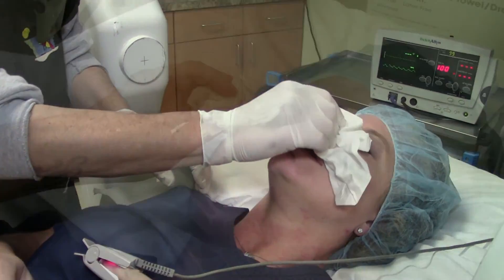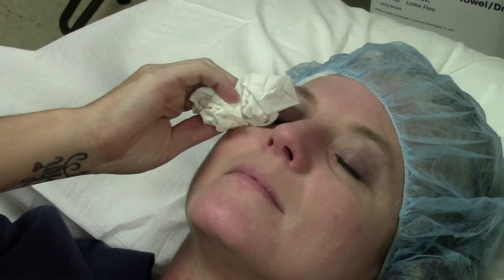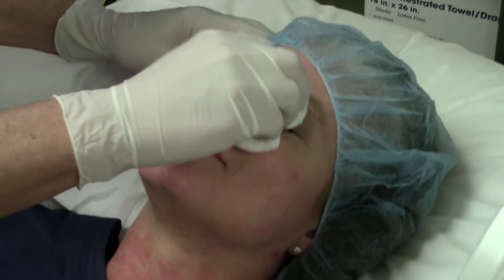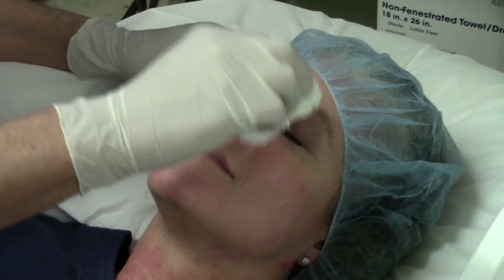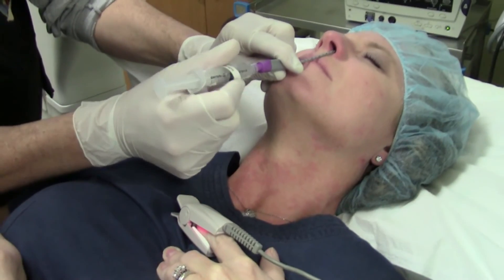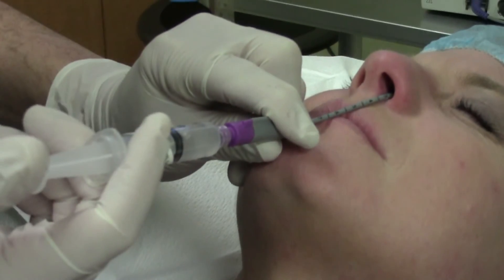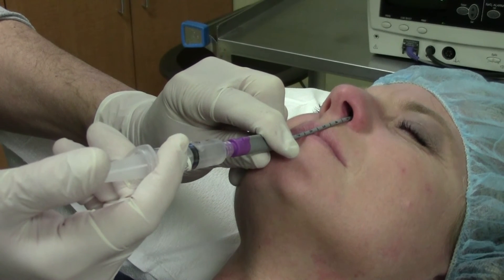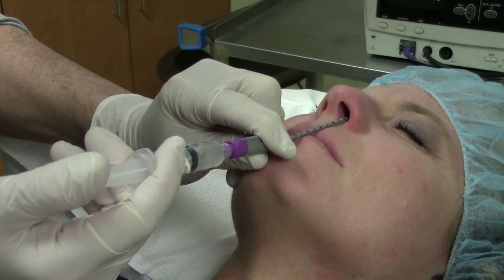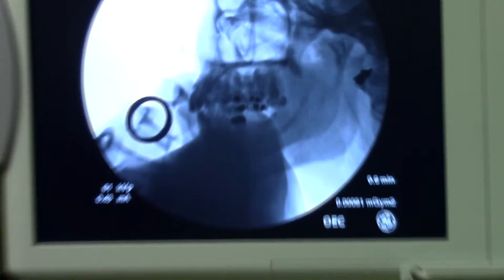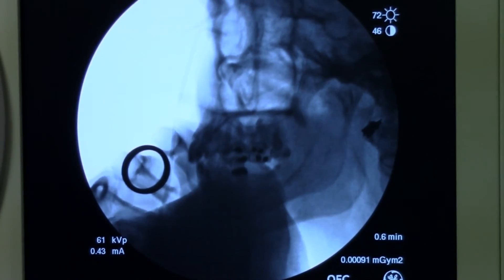As you can see, the patient is tearing, and this is an expected response when we administer medication that anesthetizes the sphenopalatine ganglion. I will instruct the patient not to swallow right at the time that we are administering the lidocaine so that she doesn't get a mouthful of the bitter-tasting substance. We have them wait to swallow for a few seconds, and then they are free to do so.